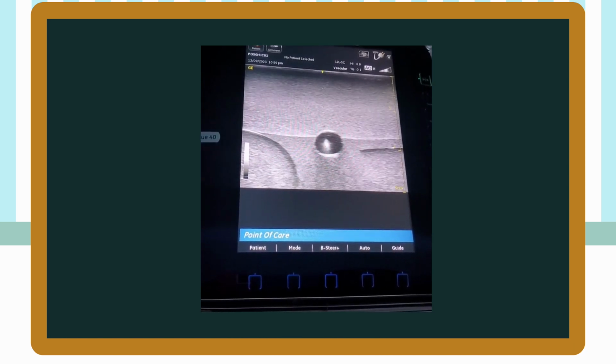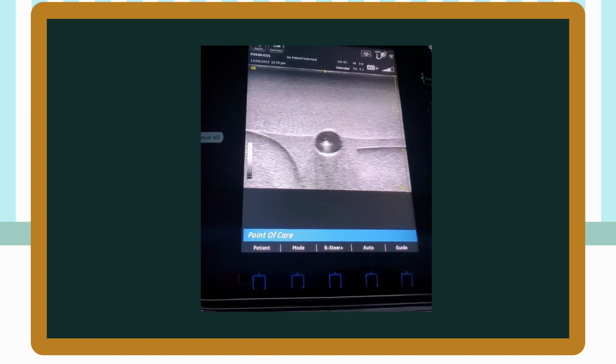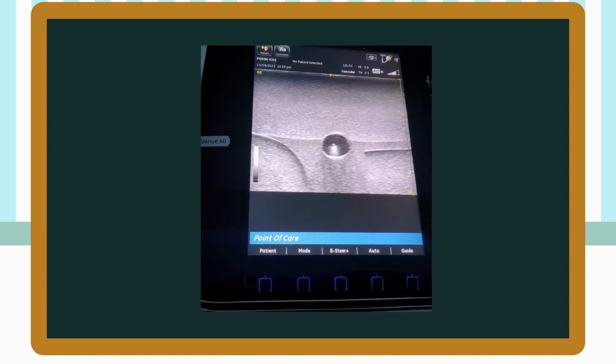Once within the vessel, the cannula should be advanced further using ultrasound guidance to increase the chance of successful cannulation and length within the vessel, as being seen on the screen.